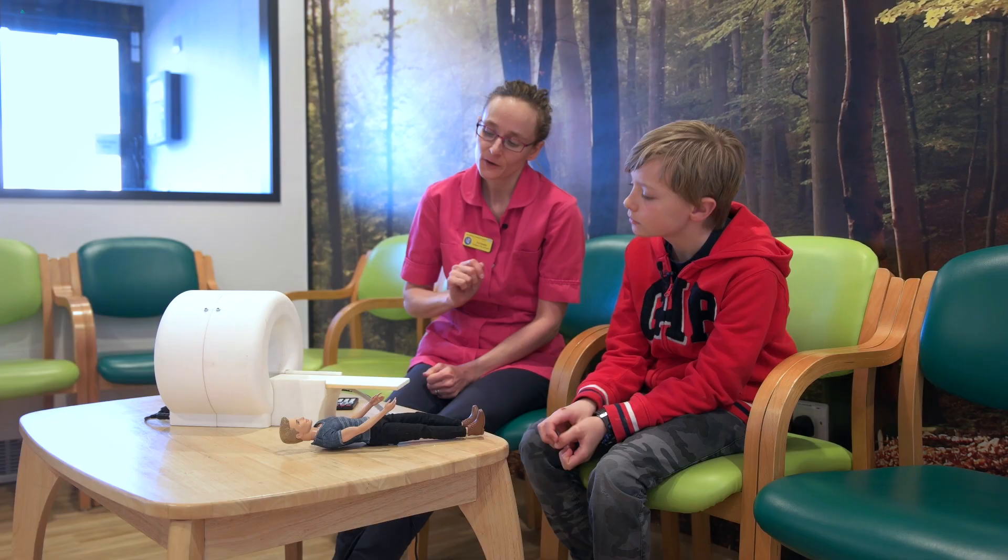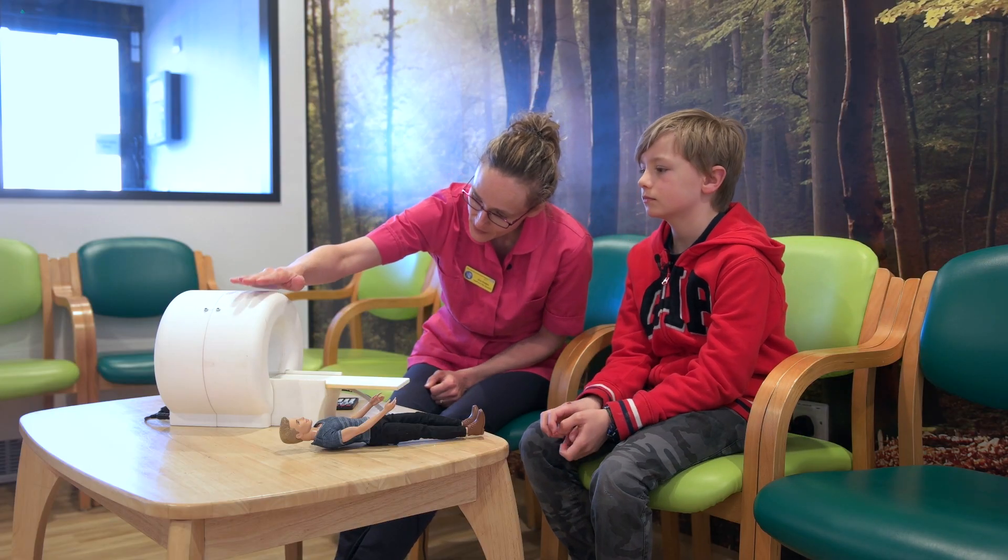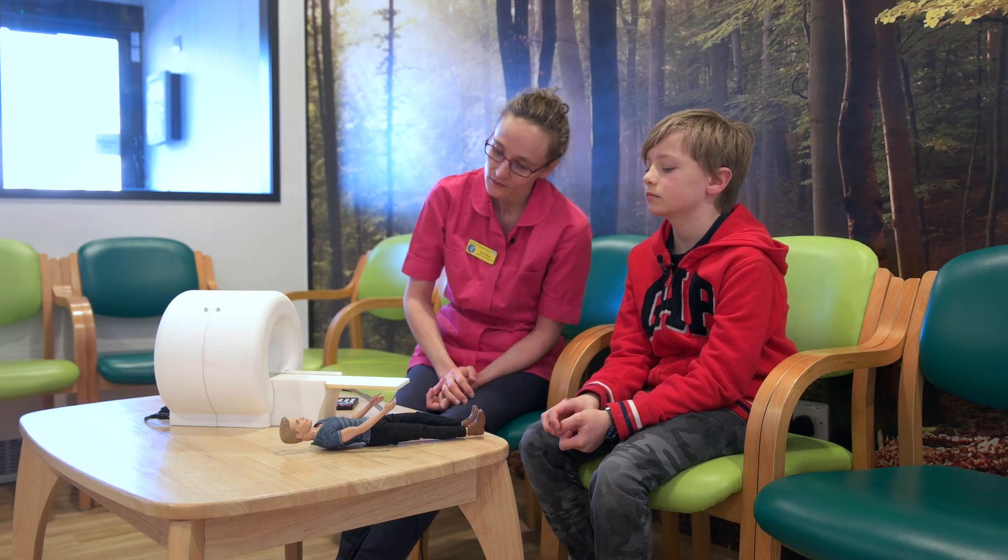My name is Zoe and I'm one of the play specialists here at the RNOH in Stanmore. As part of our role, it is our job to help children feel comfortable and safe when they're in hospital. Sometimes that means explaining things to them, like having an MRI scan.